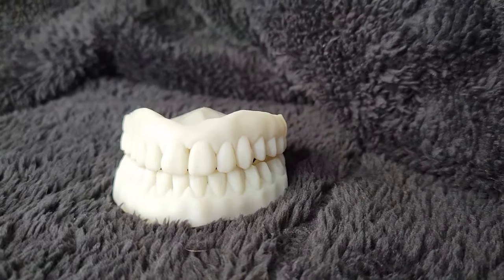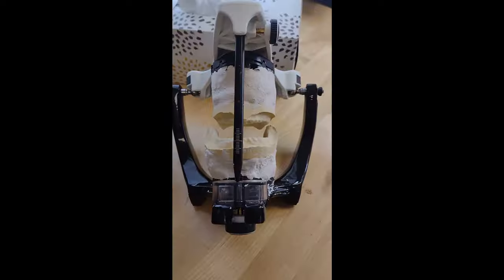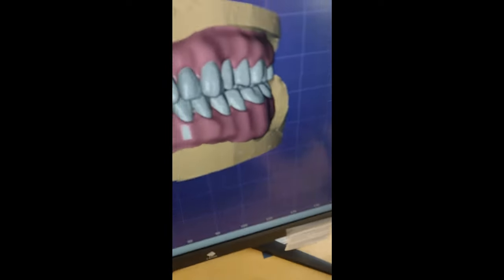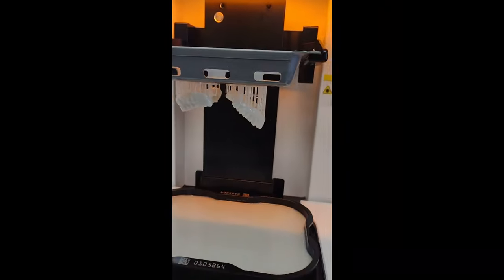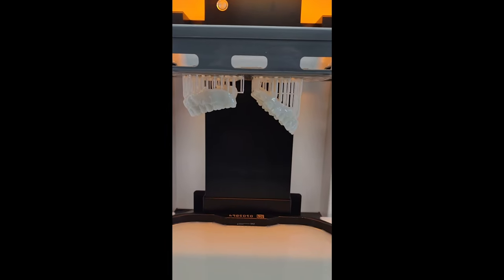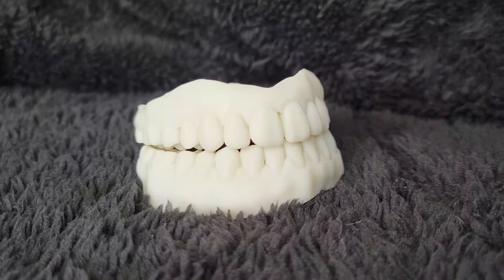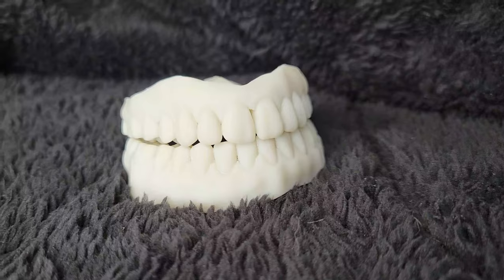These are also very, very hard. The tooth that you see in there now is printed — the actual tooth that they're going to use in your denture.